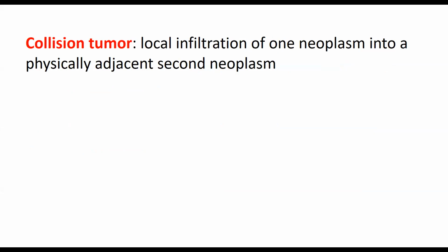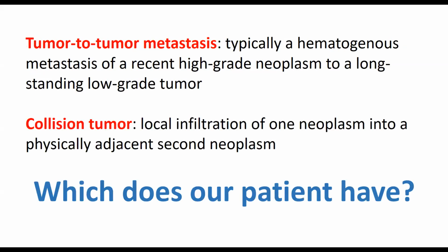And then as they enlarge, they collide with one another and they mingle with one another. Okay? Question. Now that you are empowered with this knowledge, which does our patient have? Well, I'm going to eliminate floater. And the reason why I'm going to eliminate floater is because the patient does have widely metastatic prostatic adenocarcinoma. It's not a floater. It is real.